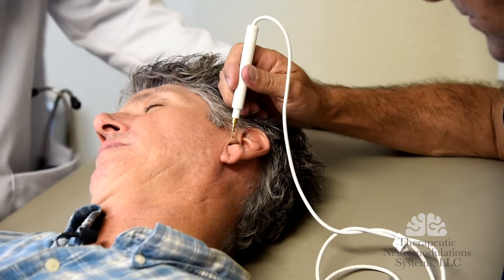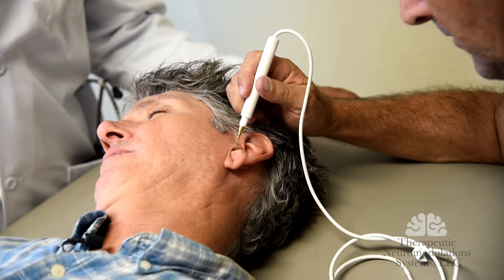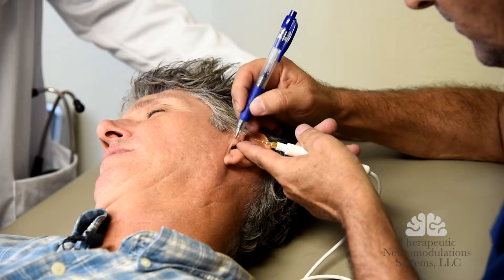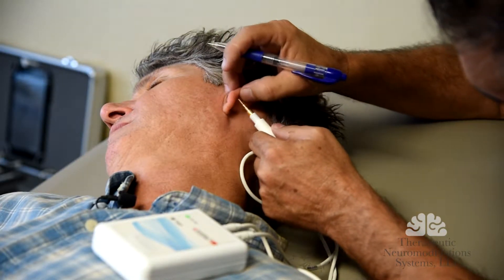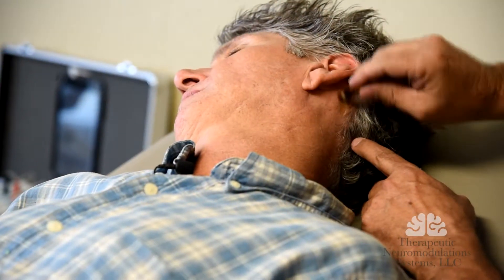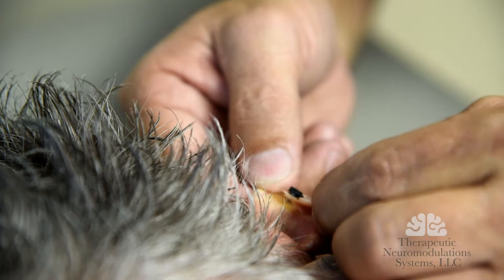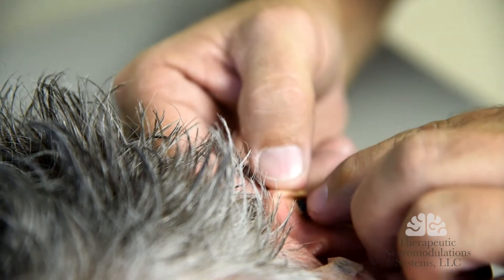This is always a tougher one to install because it's harder to get to. So we're going to put it right there. Feel a little pinch? Are you ready? Got it. We're good. That one's holding.